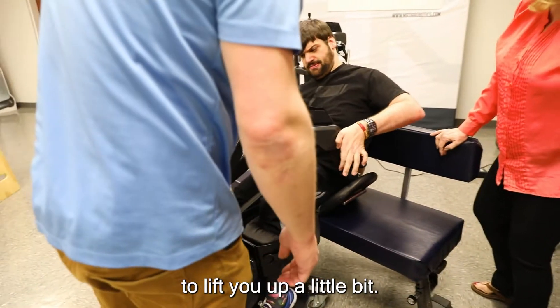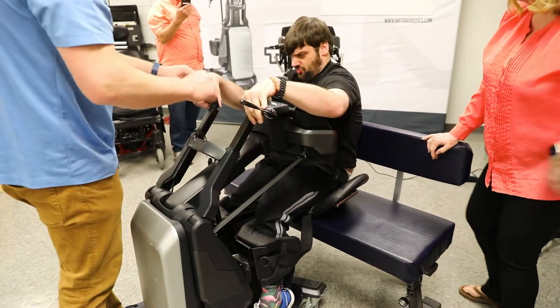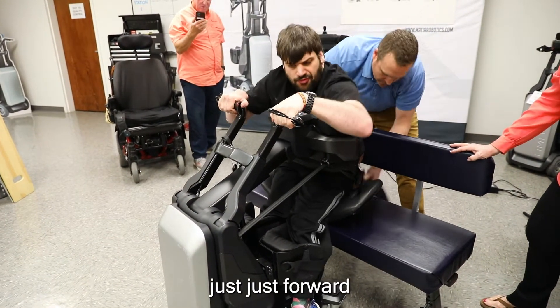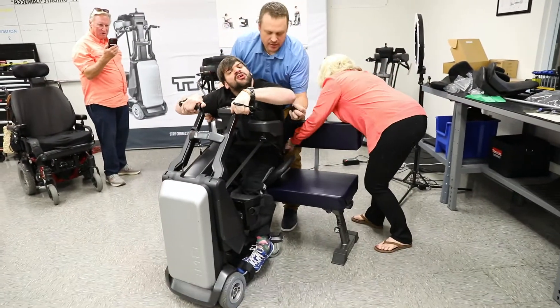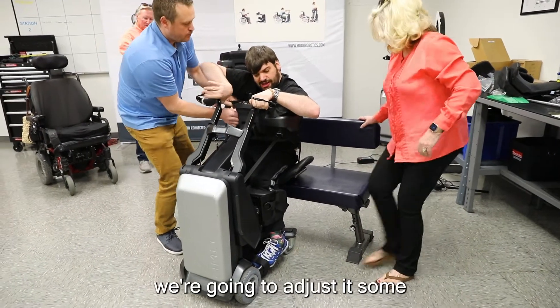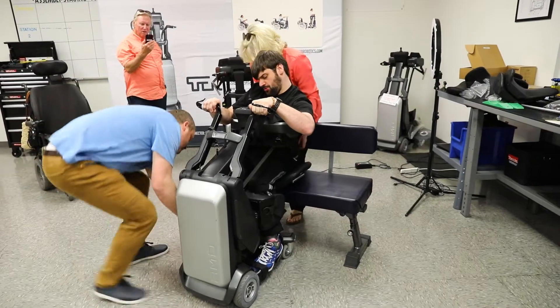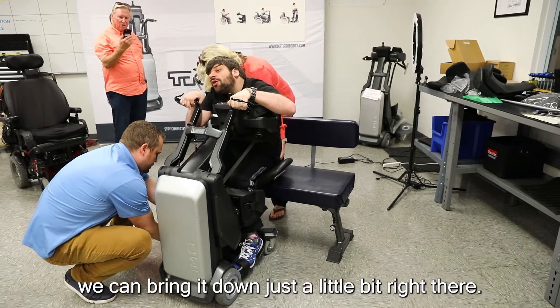Now I'm going to start to tighten them up and you'll feel it almost start to lift you up a little bit. If you can reach, put your hands right there — perfect — and just kind of pull yourself forward a little bit if you can. Not lift up, just forward. Now give us a chance to get this kind of behind, we're gonna do this up and then as we get you standing we'll adjust it.